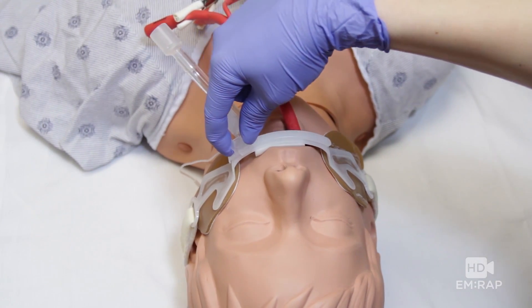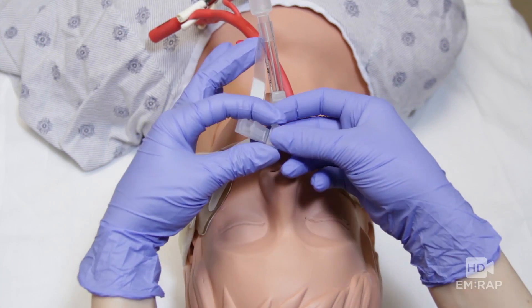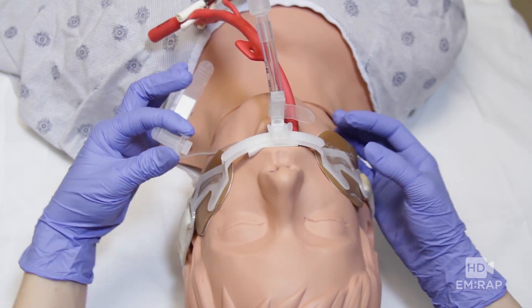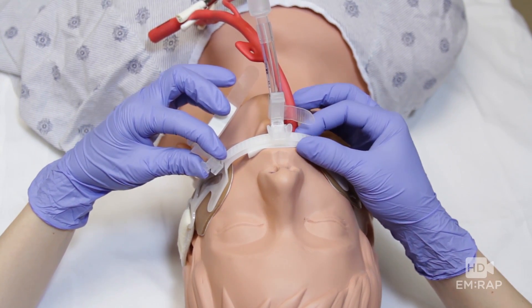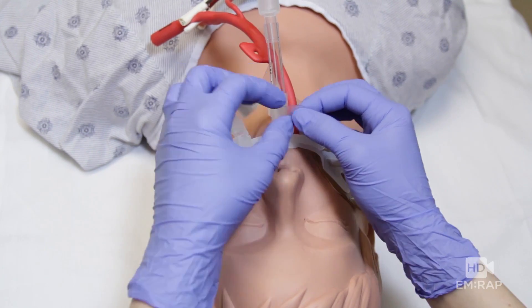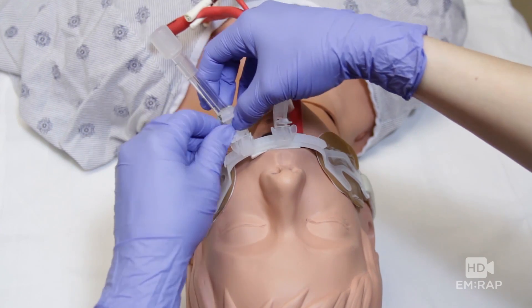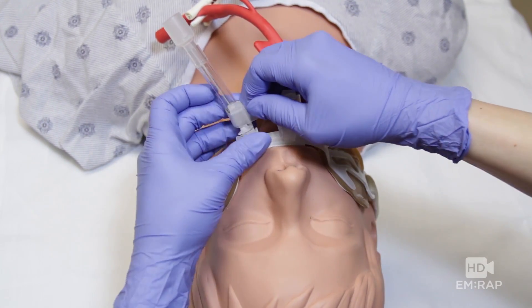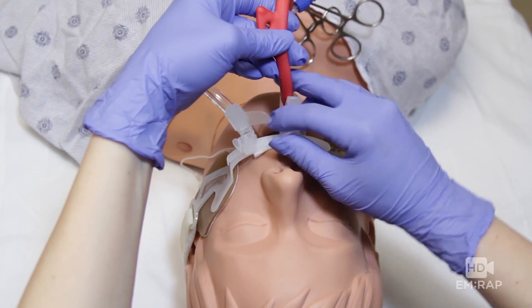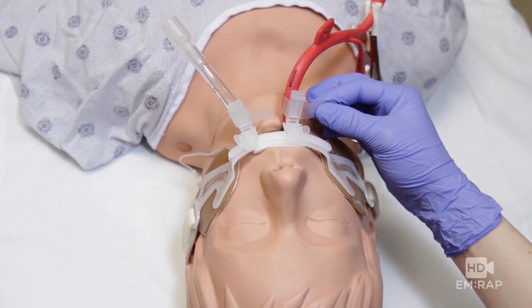Here's that alternative method — and this is thanks to Scott Weingart on the EMCrit site. You need the Hollister ETAD tube attachment device. Take a second one of these attachment devices and railroad it onto the track of the first one. Then you can switch your endotracheal tube to the one you just added and secure that in place. Now take the Linton tube, pull traction, and secure it in place with the other attachment device. No pulley system.